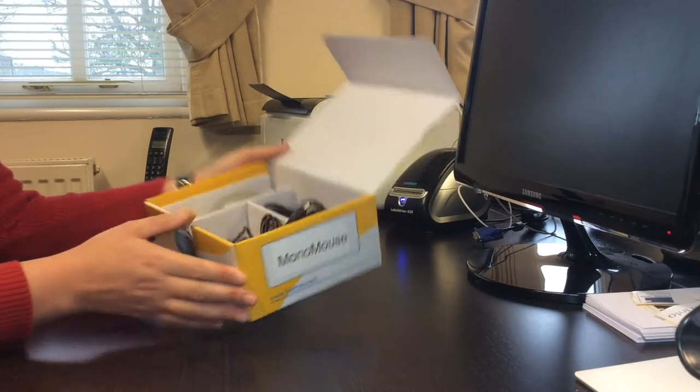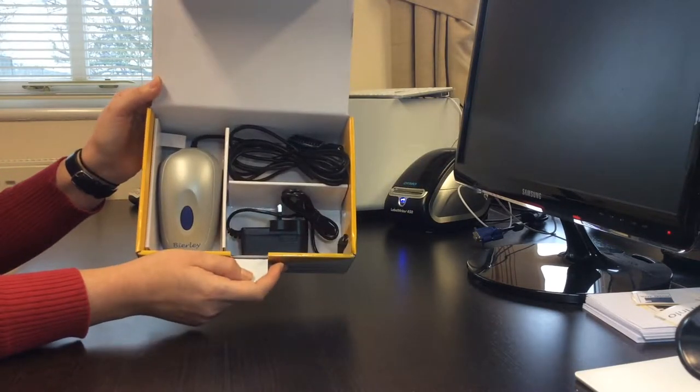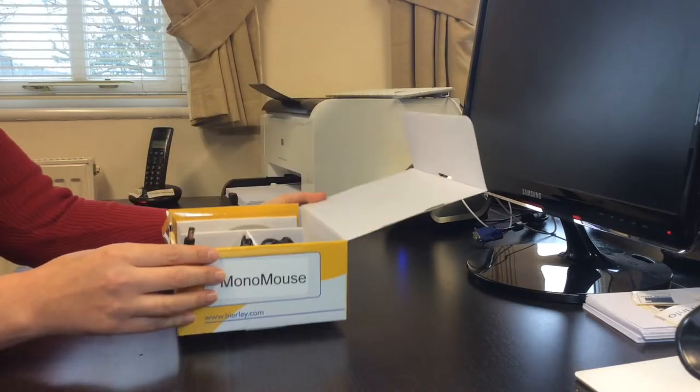This is the Monomouse electronic magnifier from Bierley, which you can use to magnify anything using your existing television.